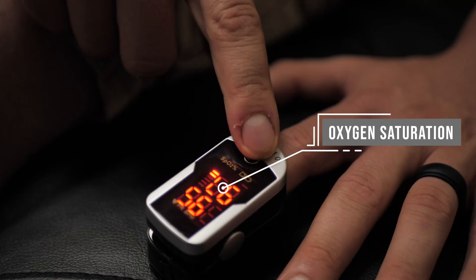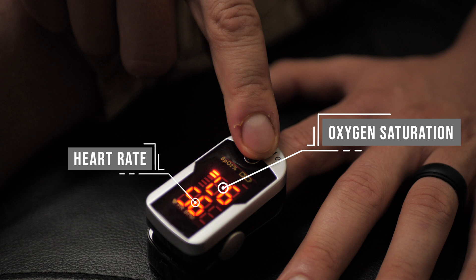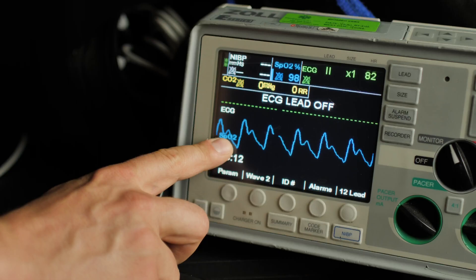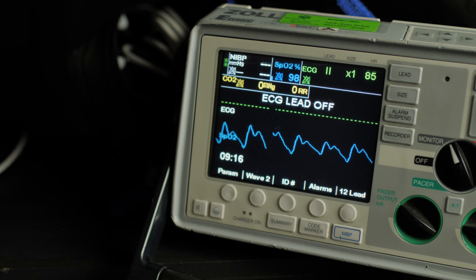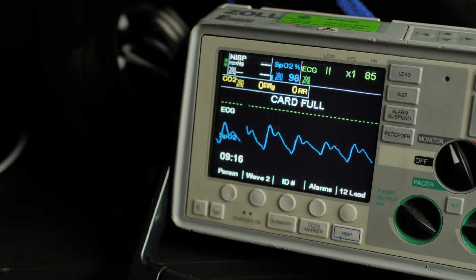A pulse ox should give you three main pieces of data: oxygen saturation as a percentage, heart rate, and some type of readout telling you how accurate your reading is. This device has a little bar that bounces up and down with the pulse — if that bar isn't bouncing from the bottom to the top on a regular basis, the data you're getting is probably not very accurate. On more expensive devices, you get an actual waveform that confirms you're getting a good reading.